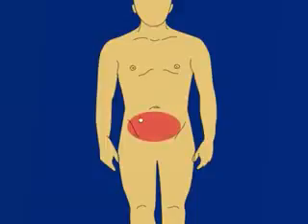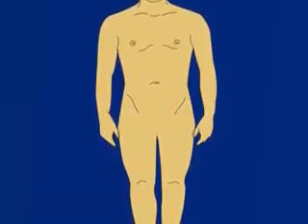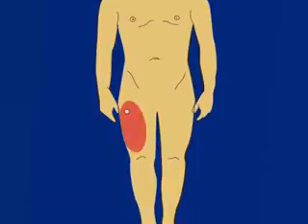To administer insulin, systematically rotate sites in one anatomical area, such as the abdomen. When all those sites are used, move to another area, such as the thigh, or start the rotation pattern over again in the same area.